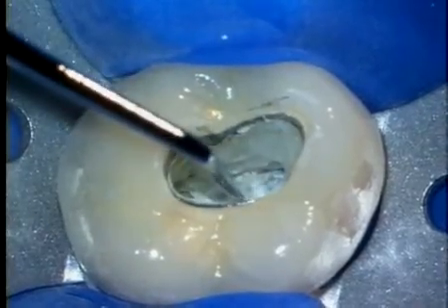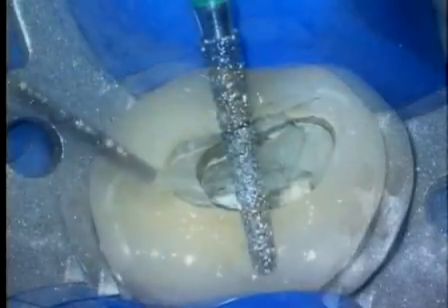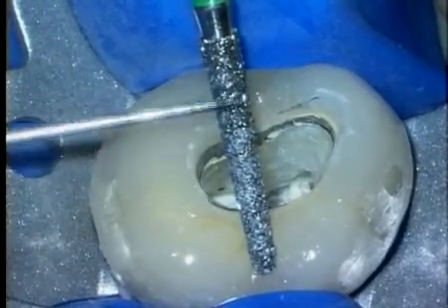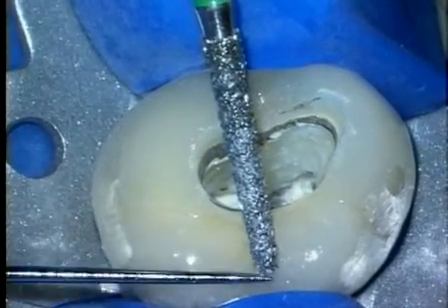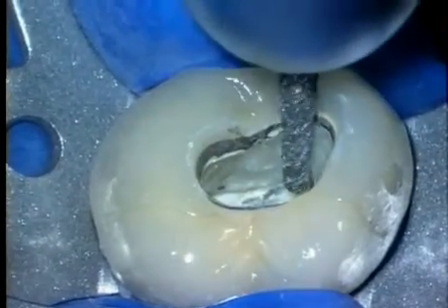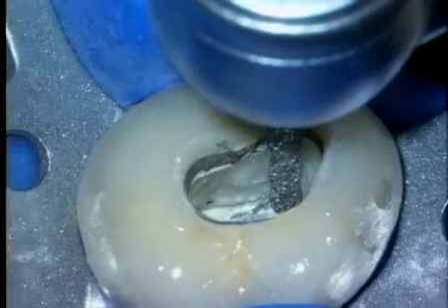Following the use of carbide round burrs, the axial walls are irregular. Therefore, we can true up these axial walls with a surgical length tapered diamond. A trick I found useful is to use just the coronal 2/3 of the cutting grit to expand the access cavity. This keeps the end of the diamond free from gouging in and ledging the internal walls. Once the access cavity has been expanded, then we can use the apical 1/3 of the diamond to marry the axial walls with the pulpal floor.